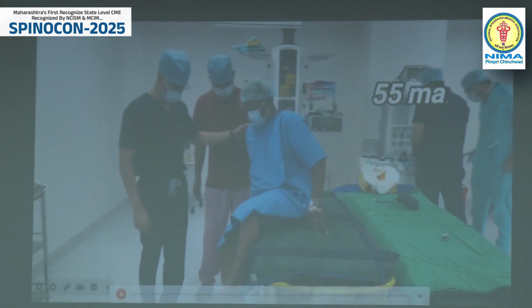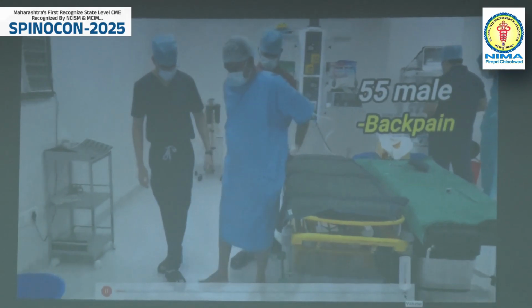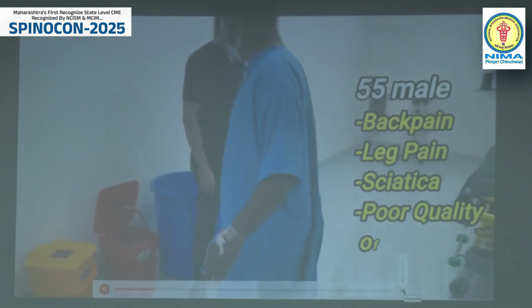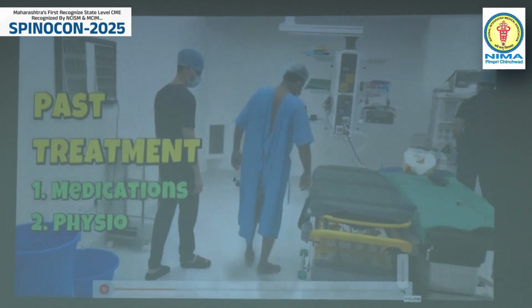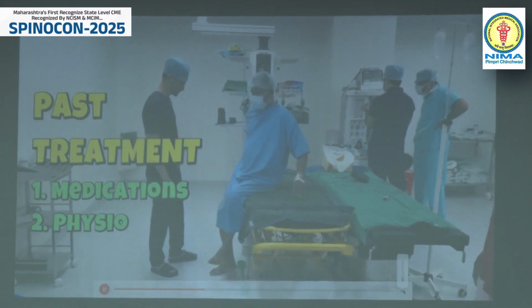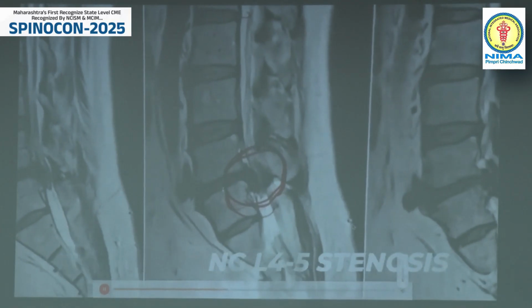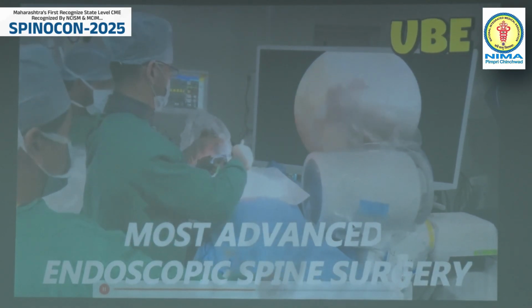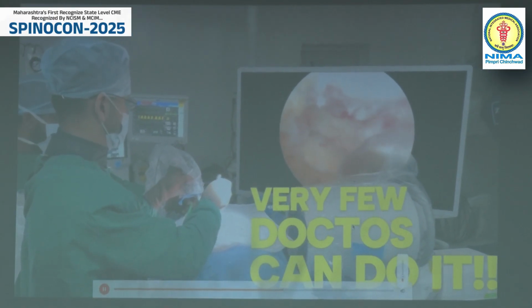This is another 55-year-old patient who had presented to us with back pain, leg pain, and poor quality of life. The patient had significant L4-5 lumbar canal stenosis. He had tried everything he could, including medications and physio, without any significant relief. So the patient was finally planned for the L4-L5 endoscopic discectomy. The patient underwent unilateral biportal endoscopic spine surgery, and the lumbar canal decompression was done.